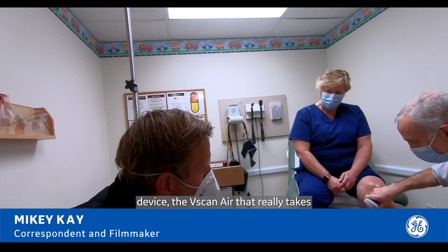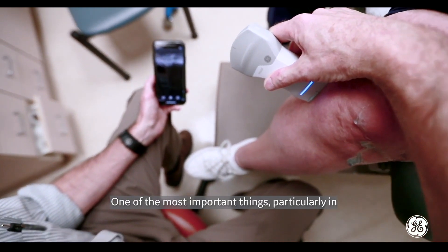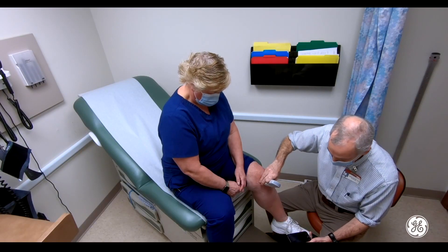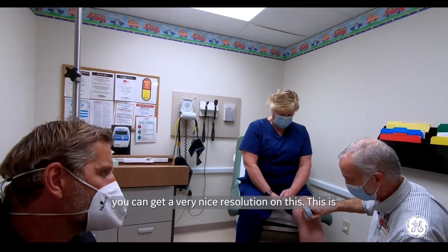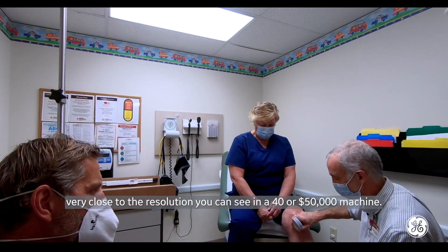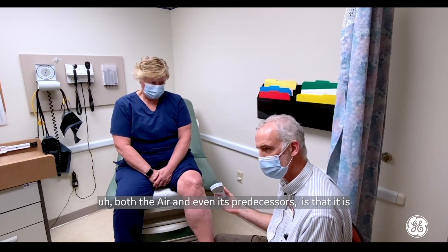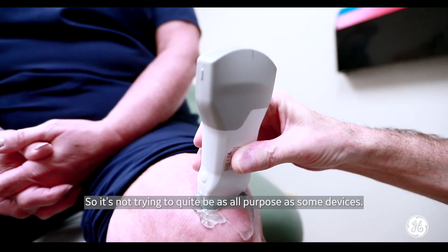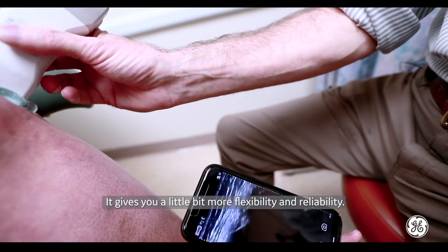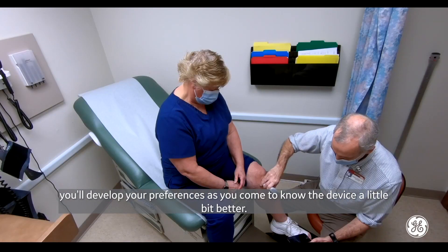What is it about this particular device, the vScan Air, that really takes your ability to practice to the next level? One of the most important things, particularly in musculoskeletal injuries — which is a lot of what we see here in urgent care — is you get a very nice resolution. This is very close to the resolution you can see in a $40,000 or $50,000 machine. The vScan Air has two separate transducers, so it's not trying to be all-purpose. It gives you a little bit more flexibility and reliability. You can still go back and forth and use either transducer, but you'll develop your preferences as you come to know the device better.